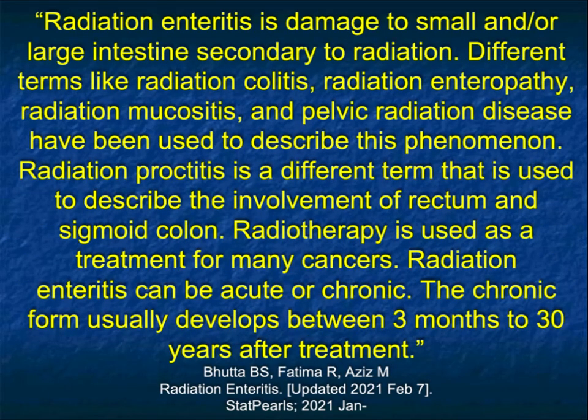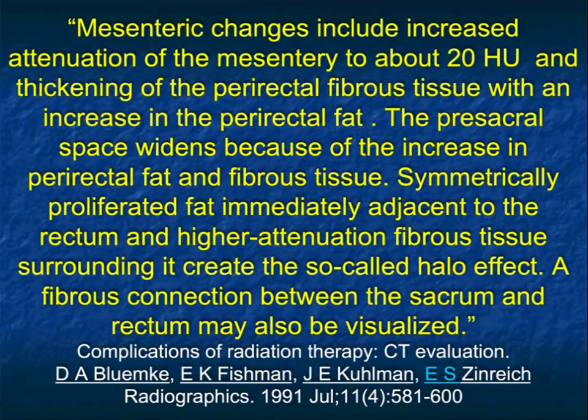It's very important to remember with radiation changes, as I mentioned, it could be chronic, but also these days with patients often getting combination therapies, as I mentioned, pancreatic cancer gets radiation and chemotherapy and then surgery. It's often hard to figure out which of the three is the problem area. But again, thinking about those possibilities will make it a bit easier.